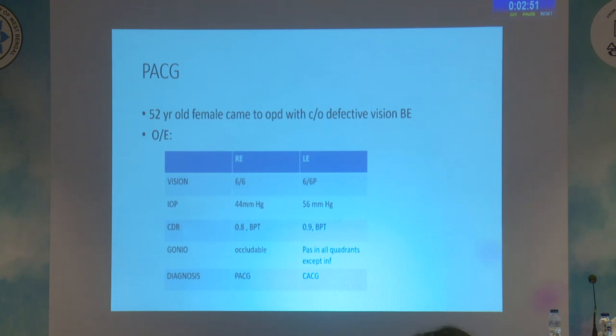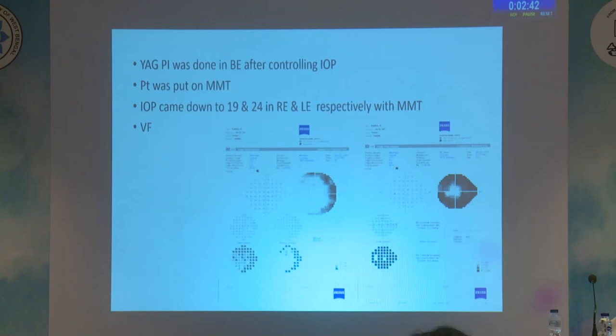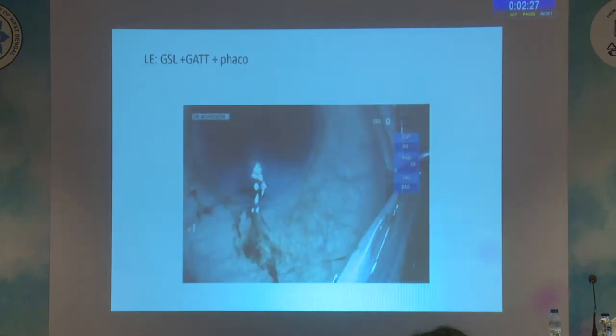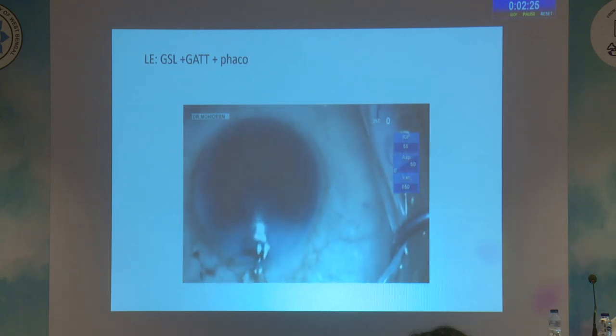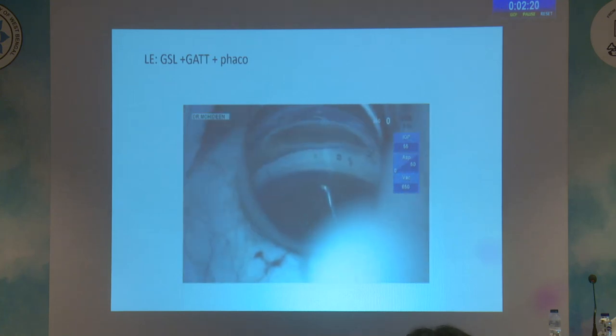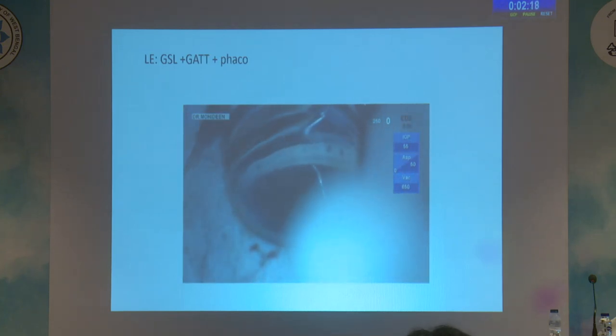So this is a 52-year-old female patient who is a known case of angle closure glaucoma and advanced cupping in both eyes with uncontrolled intraocular pressure. This patient underwent YAG peripheral iridotomy after controlling the intraocular pressure. The patient was started on maximal medical therapy and after adequate control of intraocular pressure, the patient was planned for goniosynechialysis with gonioscopy assisted transluminal trabeculotomy along with phacoemulsification.